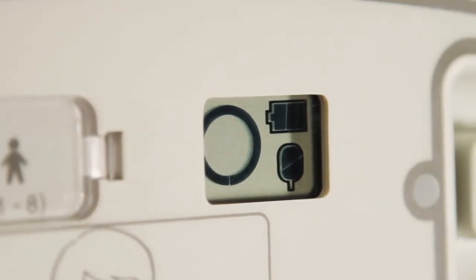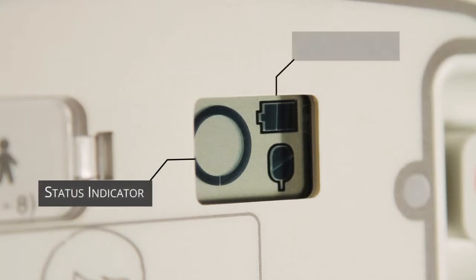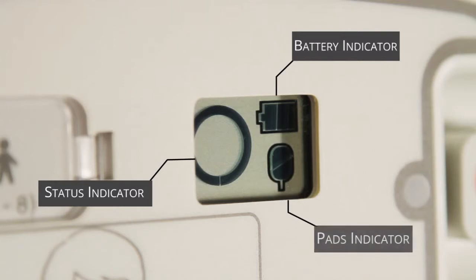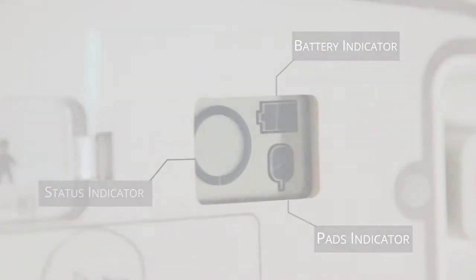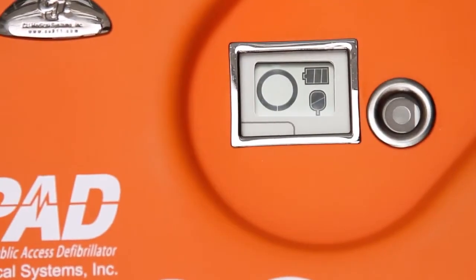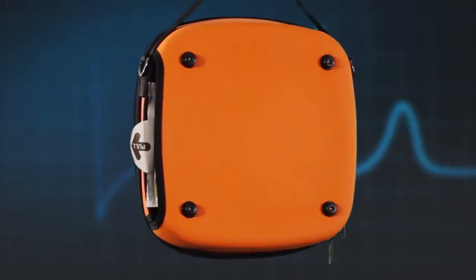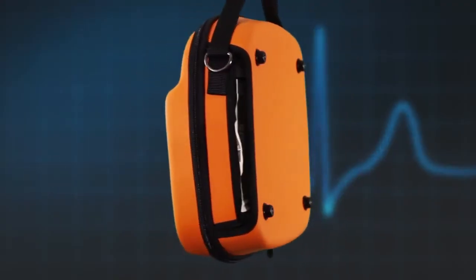This window should show three key things: one, a status indicator; two, a full battery indicator; three, a full pads indicator. How to fully check your AED will be discussed later in this film. The AED can now be placed inside the orange carry case. Gently pull the edge of the electrode pads through the slot in the side of the bag so that the pull tab is visible.